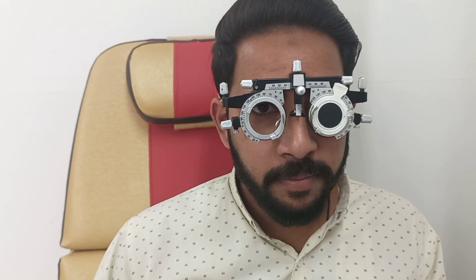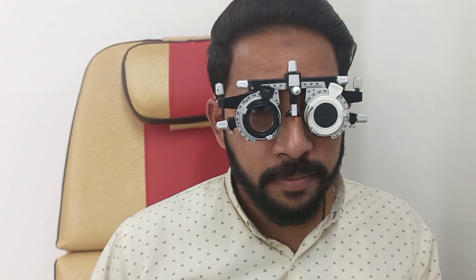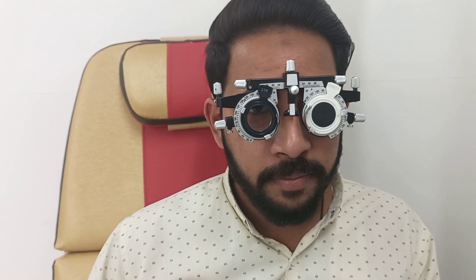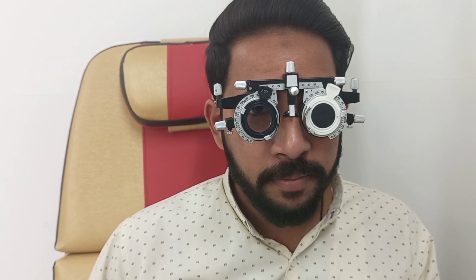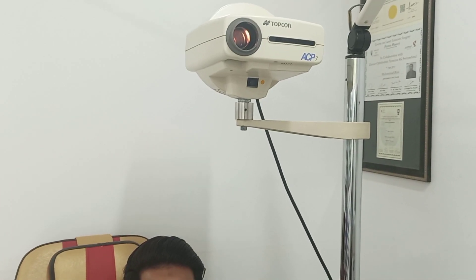The best vision sphere of our patient is plus 2 spherical, and now we will perform the Duochrome test to verify it. The Duochrome chart is placed 6 meters away from the patient, and we ask the patient to look at the optotypes — the numbers and rings — on the chart.